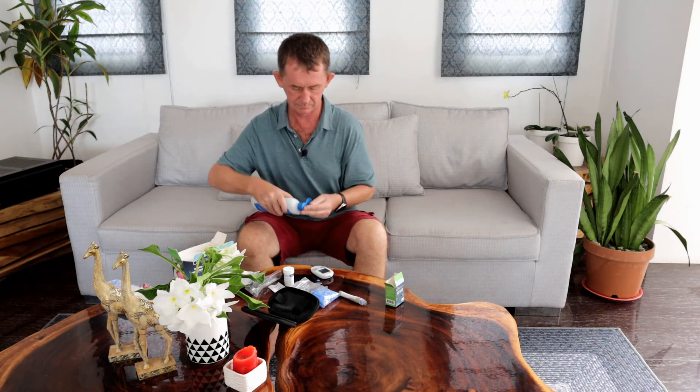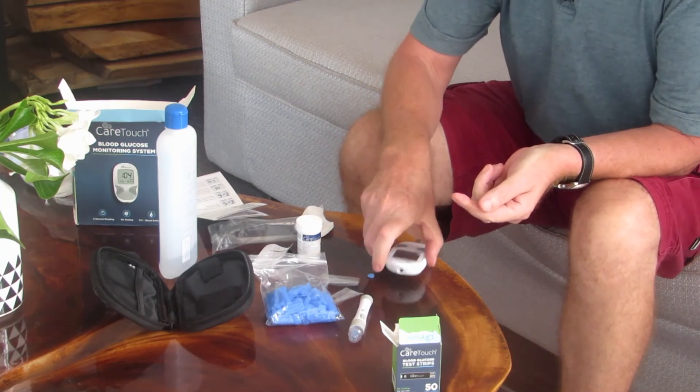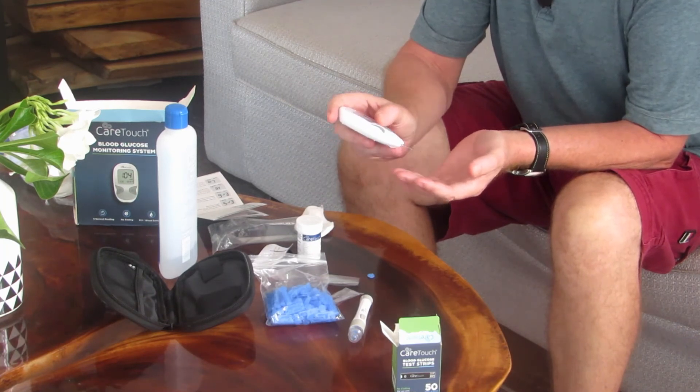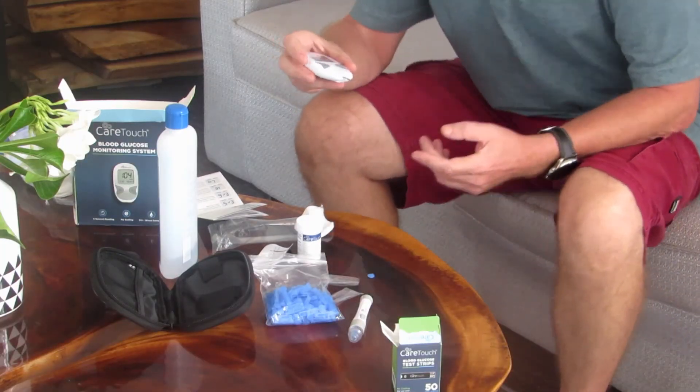I'm going to clean my finger with a little cotton wool and alcohol. Then I'm going to puncture my finger. Some people say do it to the side instead of the middle. It makes a tiny hole in my finger, so I'm going to squeeze to get the blood out. I have enough blood now. You don't put the strip down onto the finger — you put the device down onto your hand like this. It's counting down and it's giving me a reading of 115. That's a good reading. It takes only five seconds.